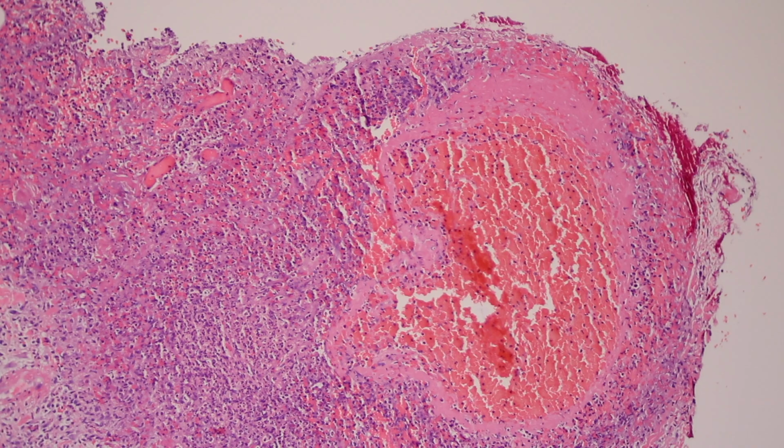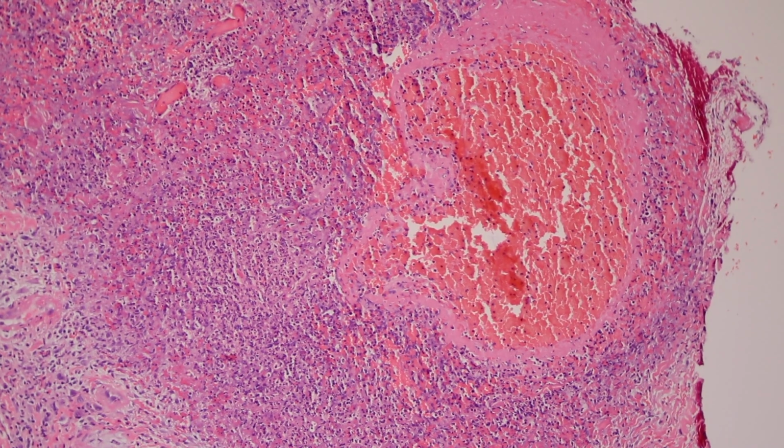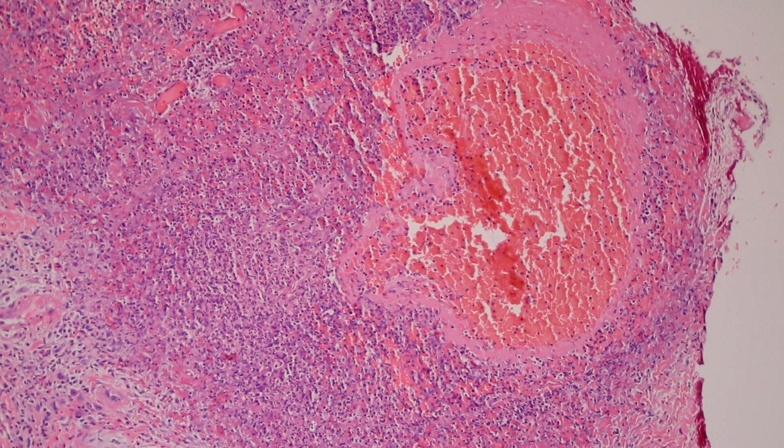So when you see a large, or what we call a medium size vessel, it's large by skin terms, but compared to the rest of your body, it's not really that large. So we call these medium-sized vessels, and they usually have a muscular wall. A medium muscular vessel is almost always in the deep dermis or the subcutis. You don't see vessels this big in the upper parts of the dermis usually. And when you have inflammation like this destroying that vessel, this is a classic example of polyarteritis nodosa, or PAN.